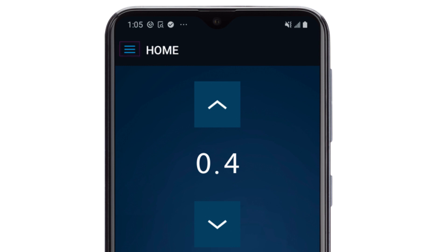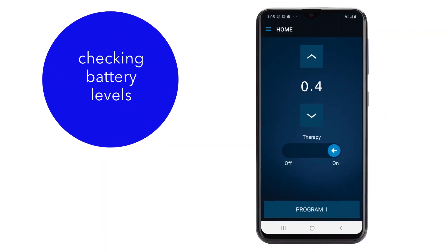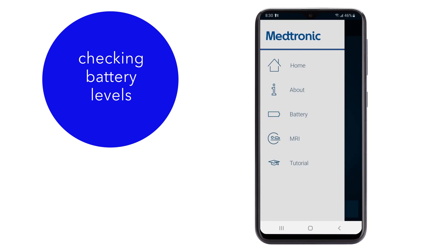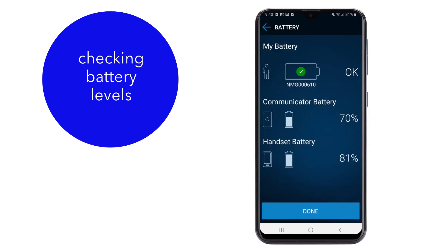The menu icon on the upper left of your screen allows you to check battery life of your internal neurostimulator, the Smart Programmer, and communicator. You can also activate and deactivate MRI mode. To check battery life, tap the menu button, then tap Battery to display the information.